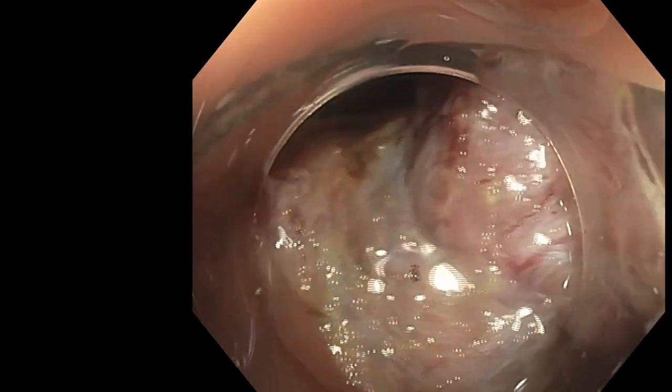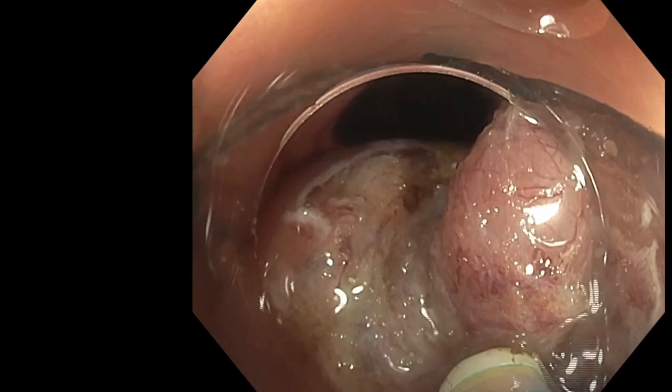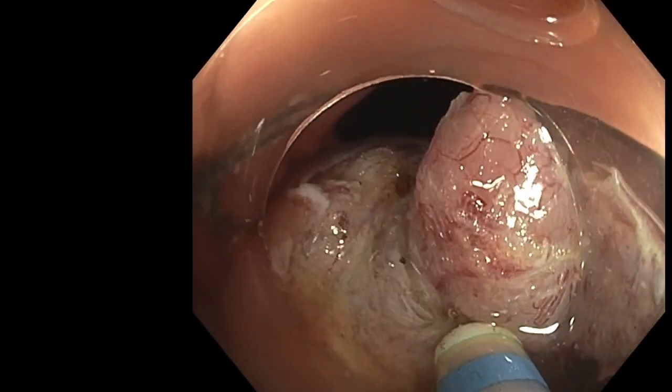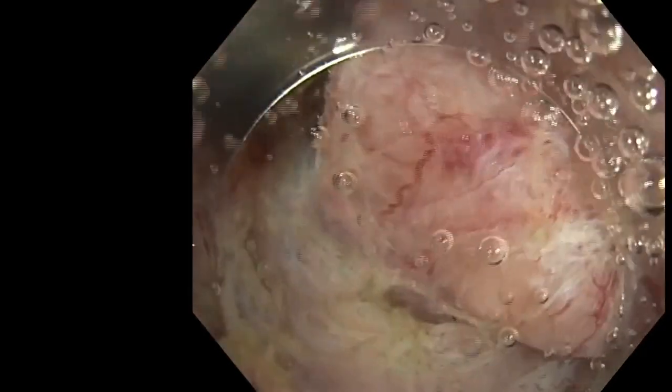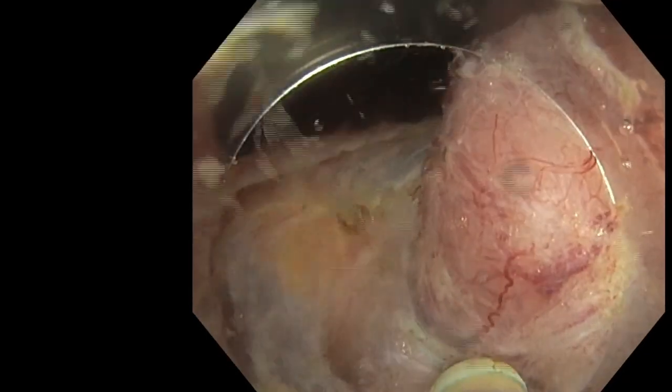So here we turn around, we try to find where are the last fibers. It's not very quick, I'm sorry, but it's exactly the same for appendiceal cases, exactly the same strategy.